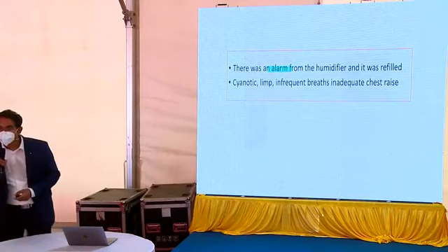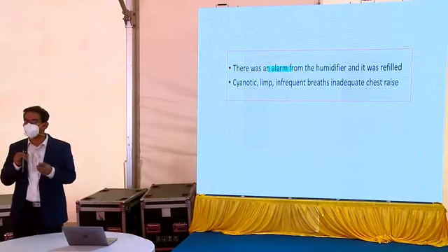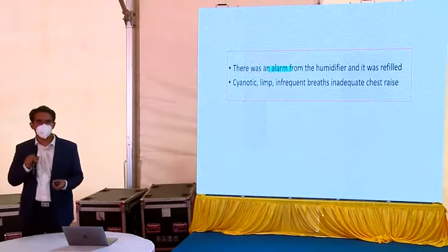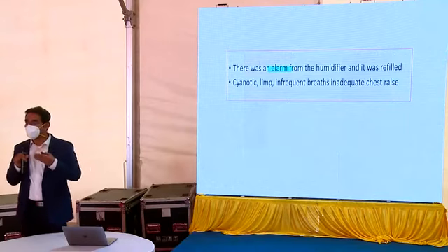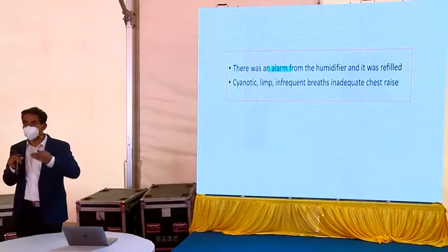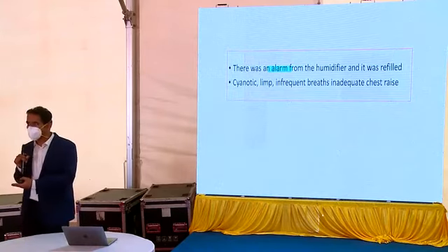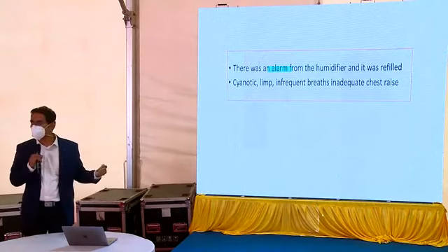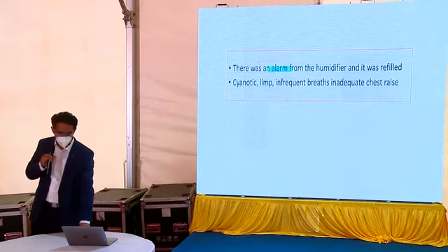Yes. Excellent. So probably that, but then there are many other things. When we say DOPE, most study material on sudden deterioration will start with D and end with E, but nowhere is it given where you should start or where you should end. It is not that you should always look for placement in the beginning or equipment failure in the end. You should quickly decide which one you are going to prioritize, and that should be based on the information you have. So, I mean, a leak just proximal to the endotracheal tube.